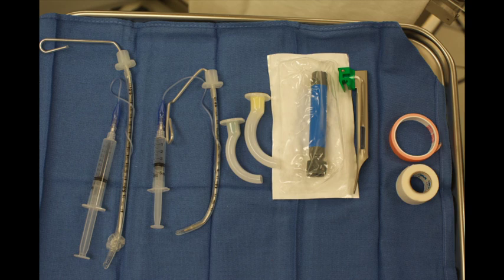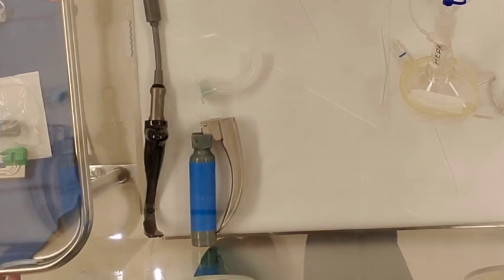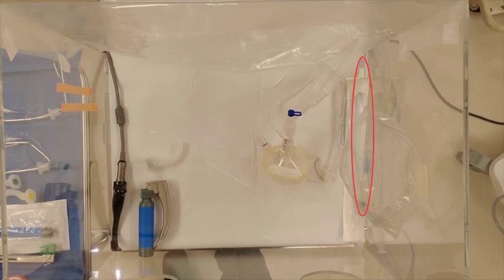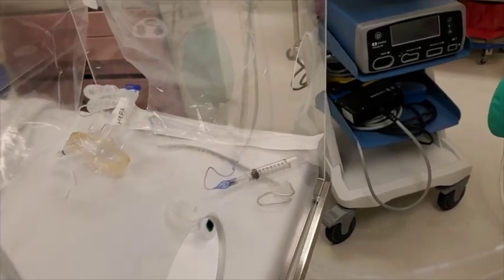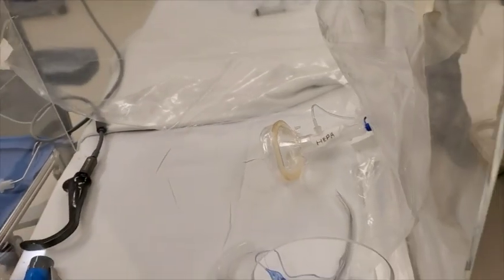The following equipment is to be placed inside the airway box: the appropriately sized endotracheal tube with half sizes above and below with pre-loaded stylets in the packaging; the appropriately sized video laryngoscope blade; the appropriately sized regular laryngoscope blade plus handle; two oral airways; a suction Yankauer in its packaging at the side of the dominant hand of the operator; eye tape and pre-cut endotracheal tube tape; and two Ziploc bags taped to either side of the box for disposing of dirty materials.